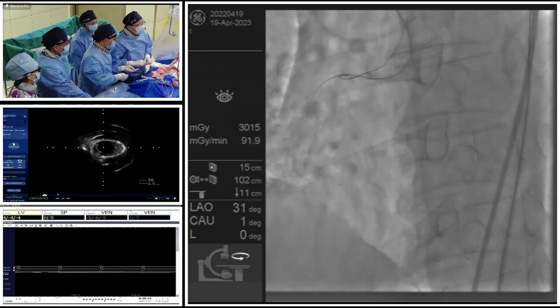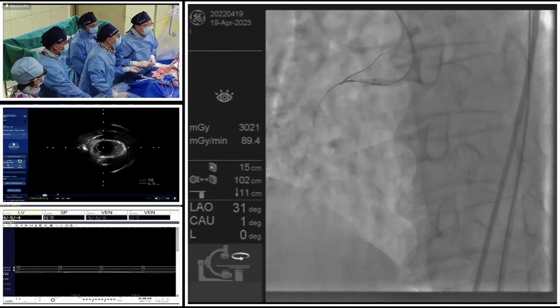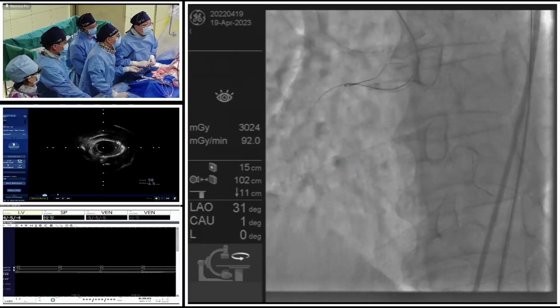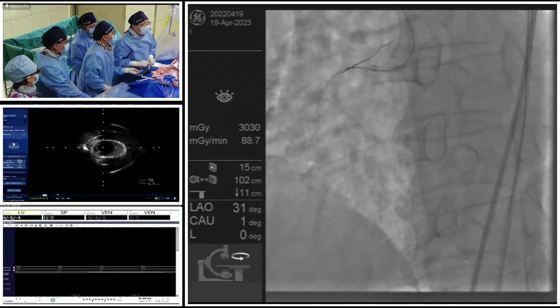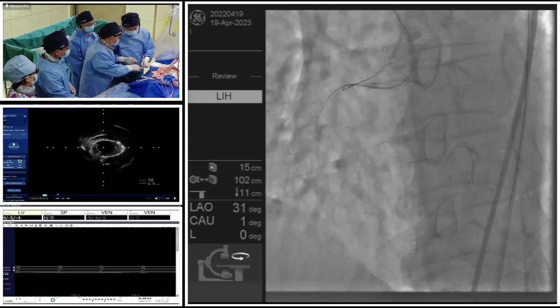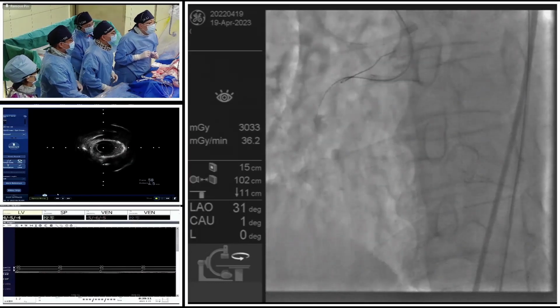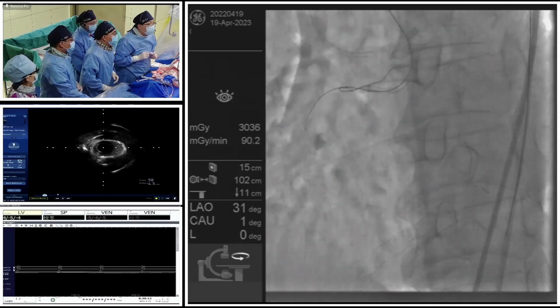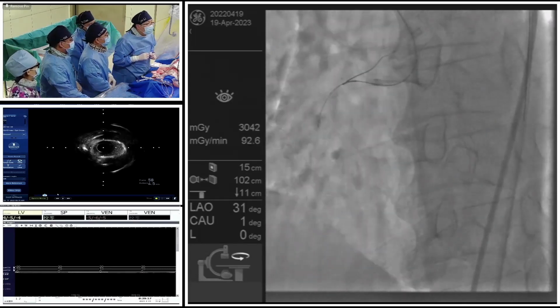Because some previous manuscripts indicated that European and Asian people have a slightly different dissection healing time. Asian people are likely to heal the dissection part quicker and better. So we allowed 3 months for this patient's healing time, and I think this is proper.